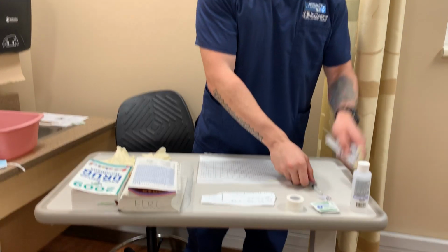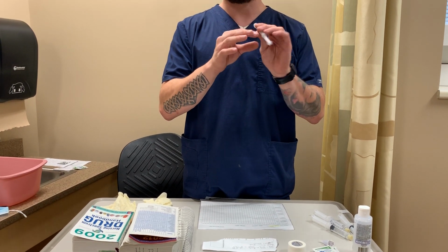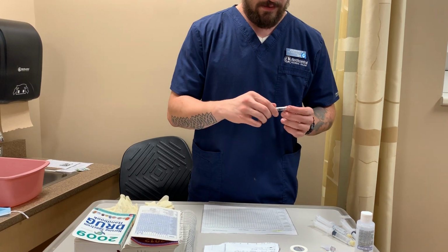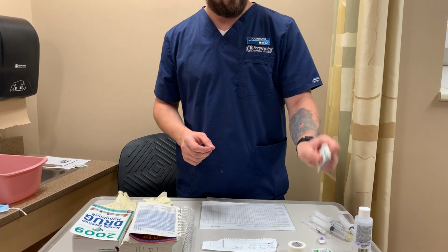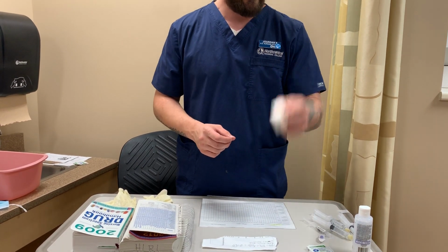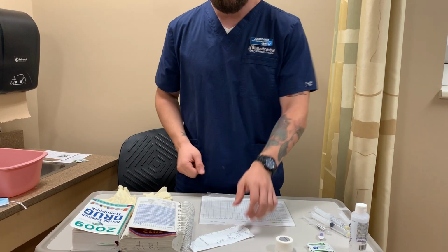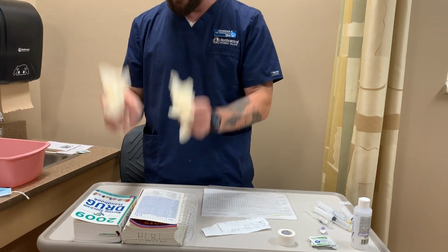All right, so I have gathered my supplies here. I have 3 10 milliliter saline flushes, all not expired. I have a drug here that is also not expired, morphine sulfate, which is 10 milligrams per 2 milliliters. I have a vial access device, some alcohol prep pads, some paper tape, which I have pulled a piece off for our label, some hand sanitizer for hand washing. I have my math book, drug book, and some clean gloves.